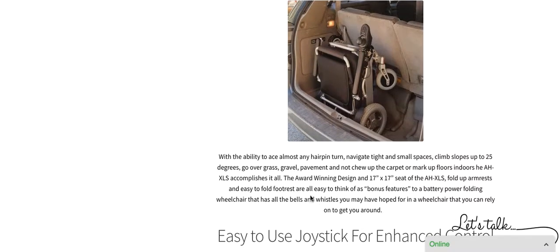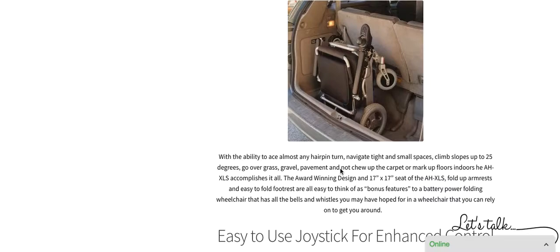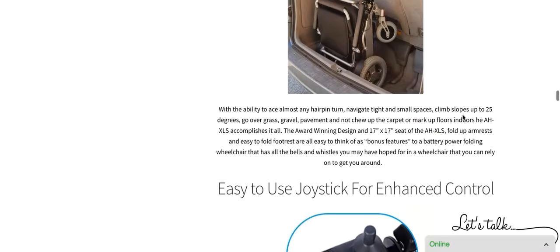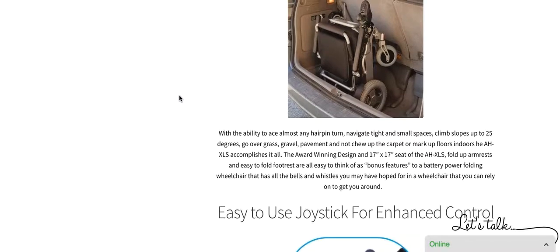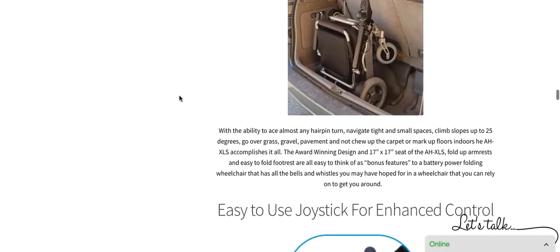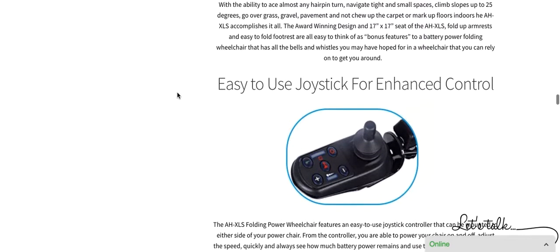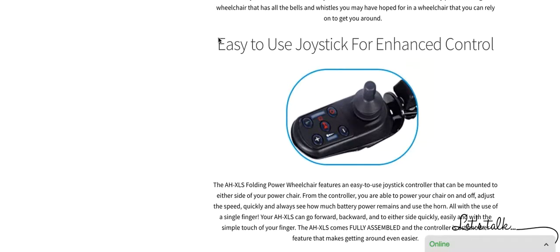The AHXLS also has the ability to literally do 360s or turn on a dime. It goes forward, backwards, right, and left. Anything that you can tell the joystick to do, the chair does. And it handles very quickly, very efficiently. It has a seat that is 17 inches by 17 inches. So it has a larger cushion than most fold-up power chairs in the industry.